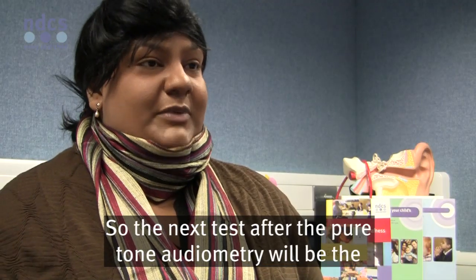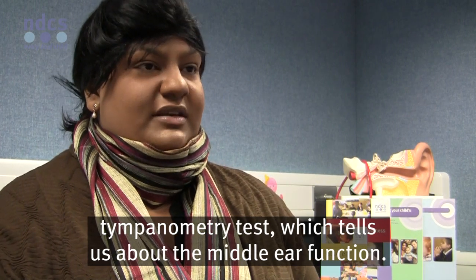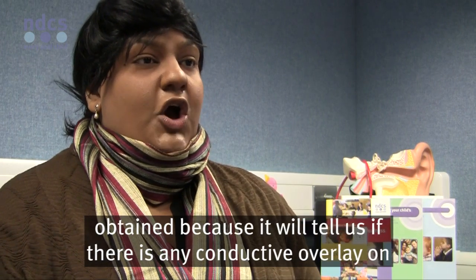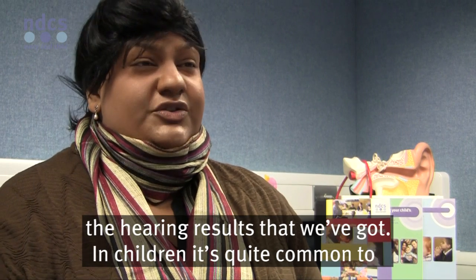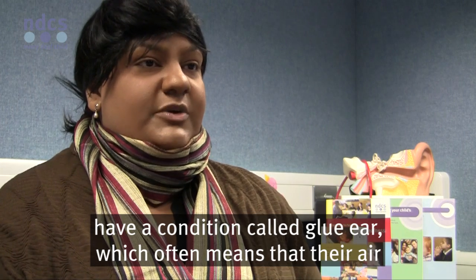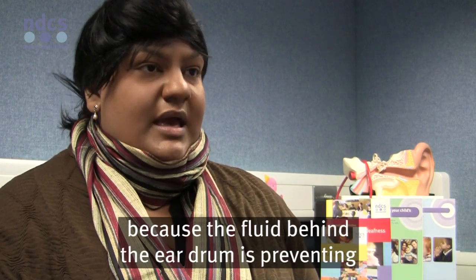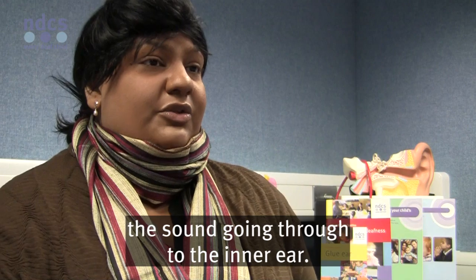The next test after the pure tone audiometry is the tympanometry test, which tells us about middle ear function. It's a great test to use in conjunction with the hearing test results, because it will tell us if there's any conductive overlay. In children, it's quite common to have a condition called glue ear, which often means that their air conduction results will be worse than the bone conduction results, because the fluid behind the eardrum is preventing sound from reaching the inner ear.